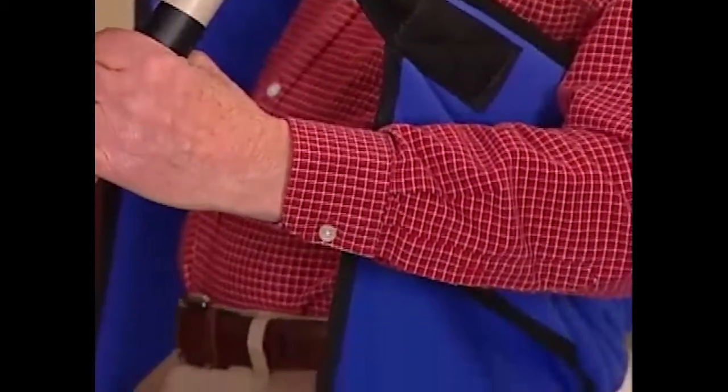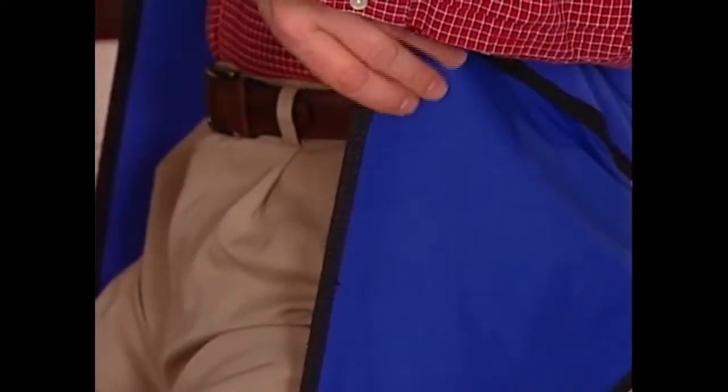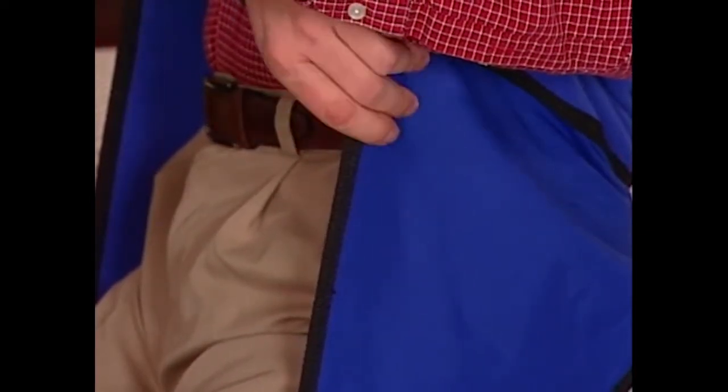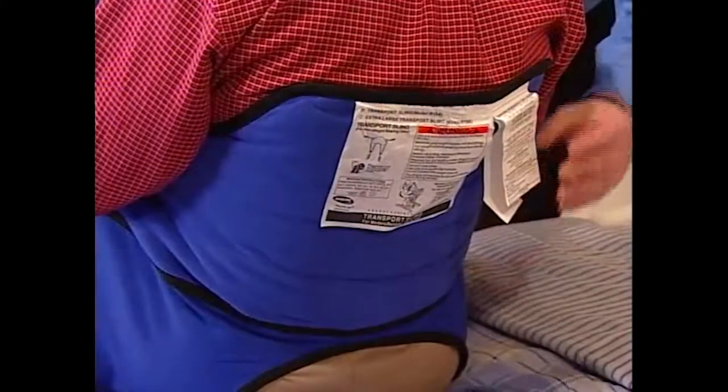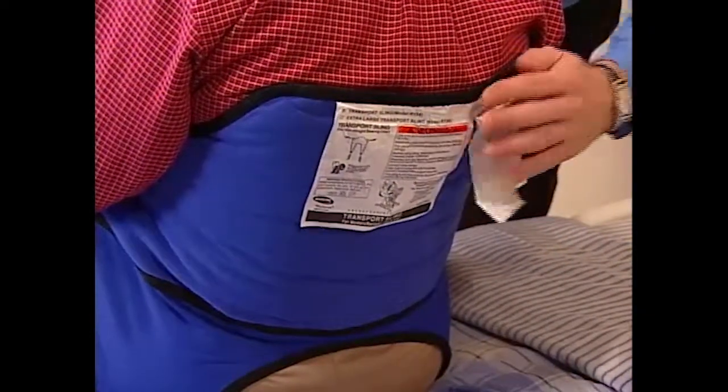Invacare Transport and Transfer Stand Assist Slings are constructed of durable materials that resist deterioration from moisture and laundering. Sling sizes are indicated on the labels. Refer to the sling chart in the Owner's Manual for dimensions.